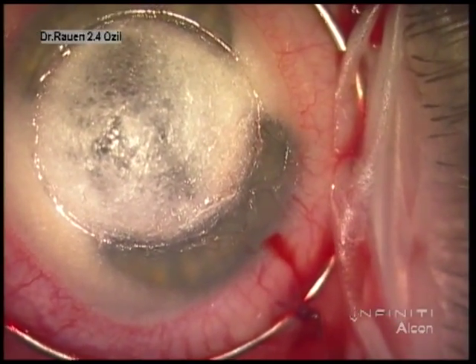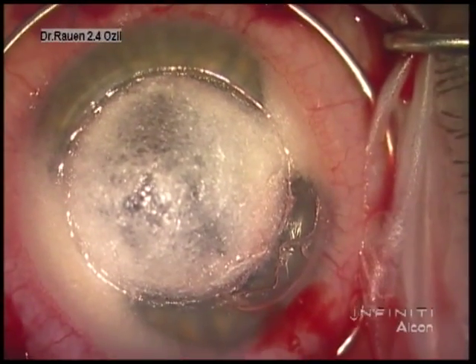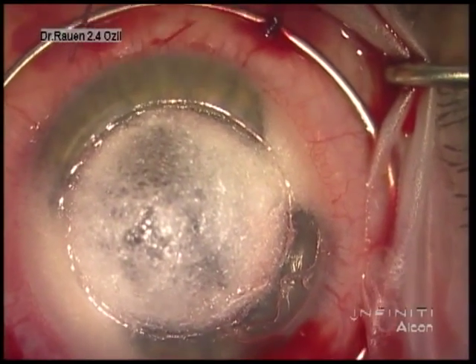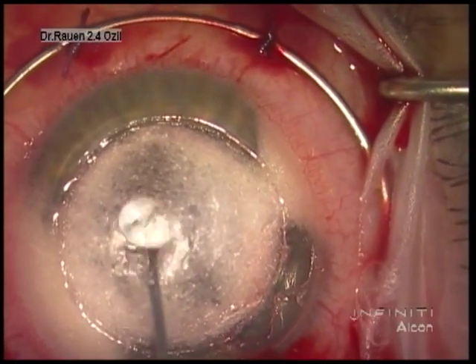We see that large egress of fluid because the anterior chamber pressure is high. We place a peripheral air bubble in this case, and you can see that bubble remains in the periphery, also suggesting that Descemet's membrane has moved posteriorly within the central cornea.